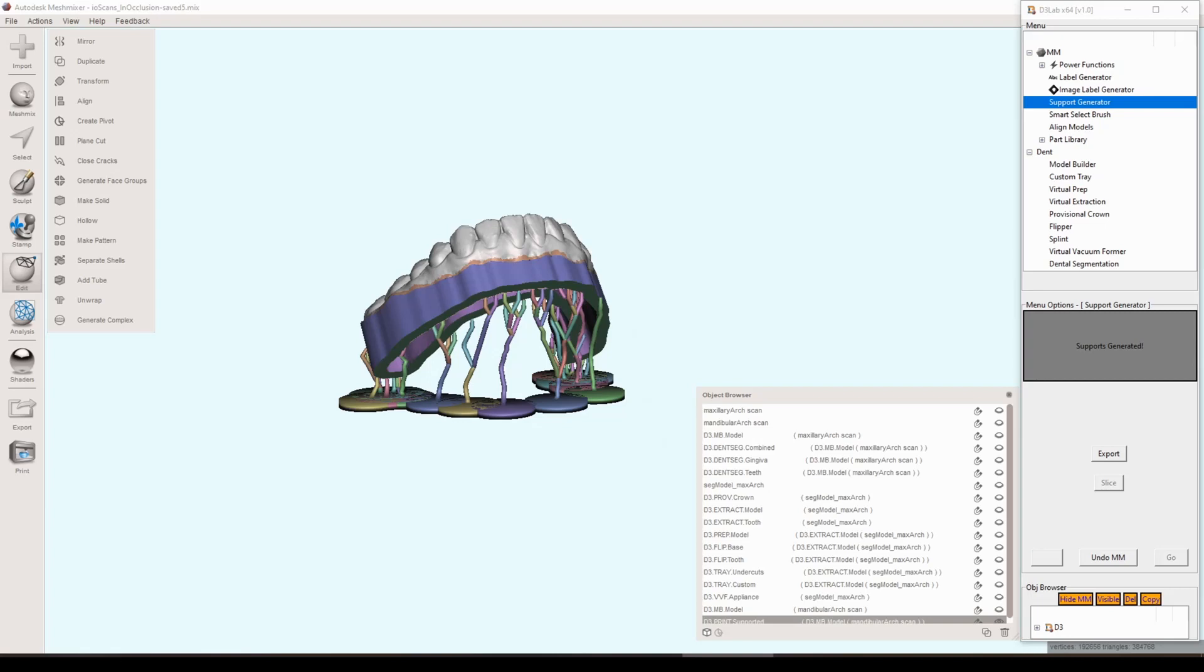That's the 3D print support tool, and then we went over the image label generator and the text label generator. I really appreciate taking the time to watch this video. We're kind of getting to the end of the majority of the features that exist currently in d3 lab, but again thank you so much for your time and have a wonderful night and I'll talk to you later.